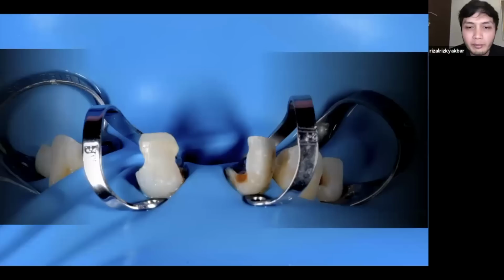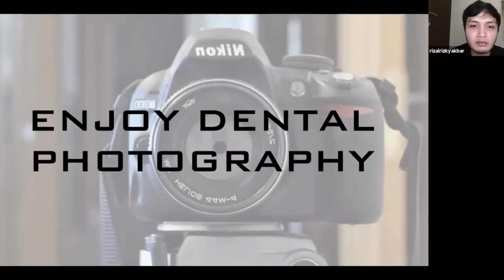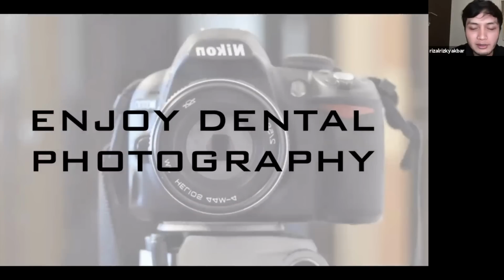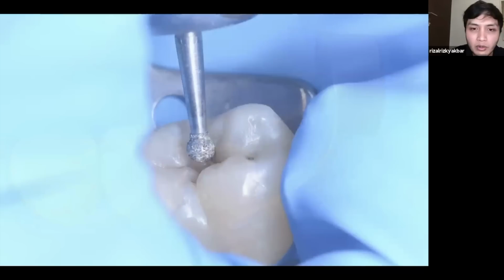This is an example. I can put rubber dam even for such a complicated case like this, or for posterior. But like I said before, posterior is more complicated, but you can do it with experience. And the E is enjoy dental photography. So you can see here, this is a simple picture, but it turns out to be very artistic because of the rubber dam. It provides me with a kind of natural reflector. So the simple picture will be so beautiful if you use rubber dam.